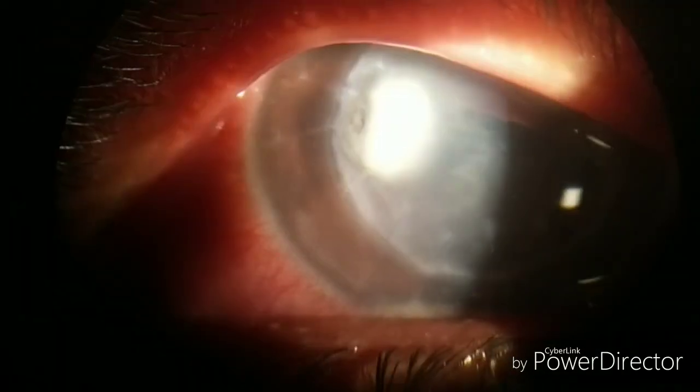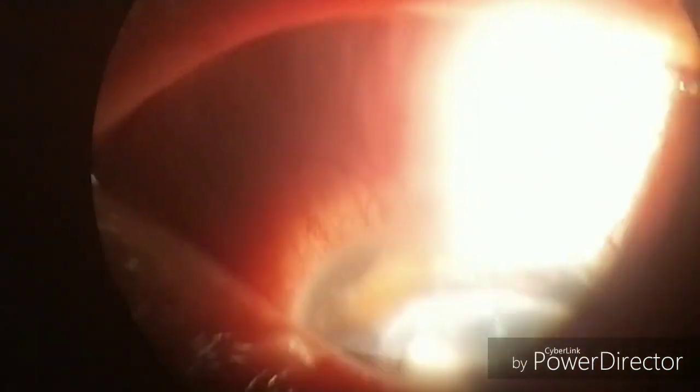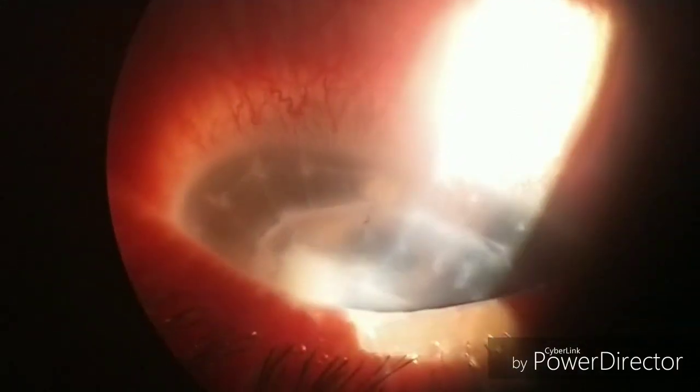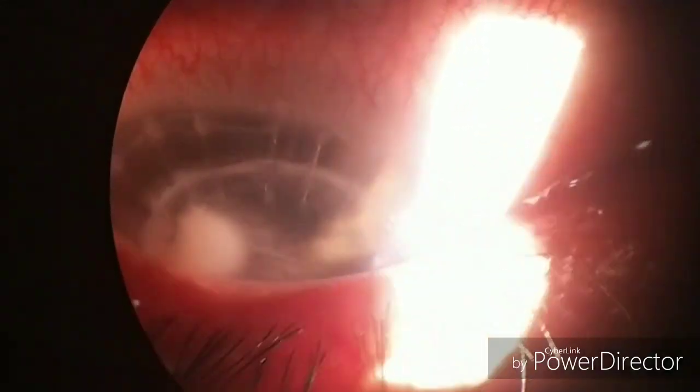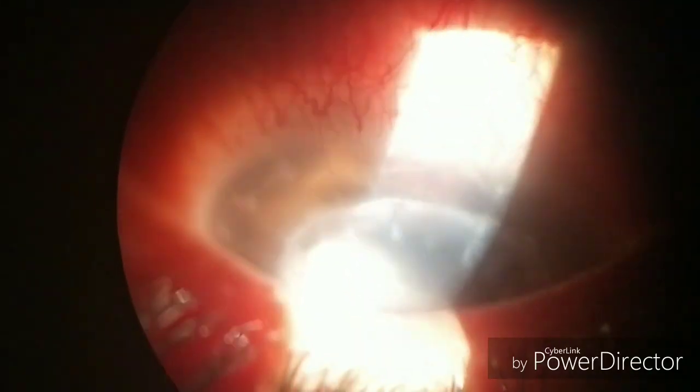First, I would conclude our case: as you can see, there are no stitches, so it's an old case performed more than a year back. Unfortunately, the last remaining loose stitch was removed peripherally by untrained personnel with unsterilized instruments, which resulted in infective keratitis in the graft — one of the important and drastic complications, as you can clearly see.